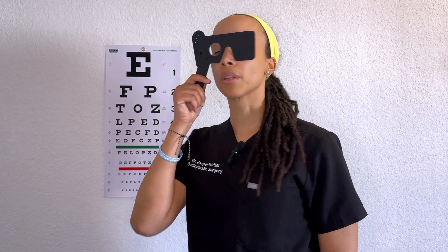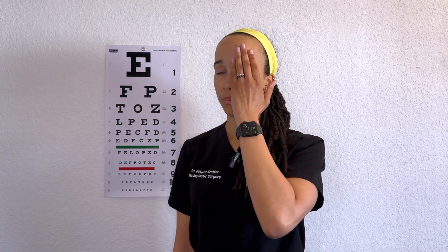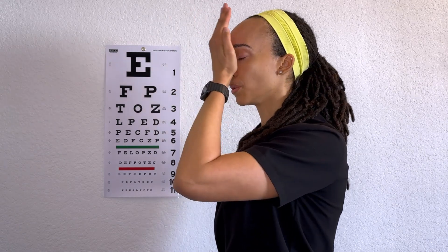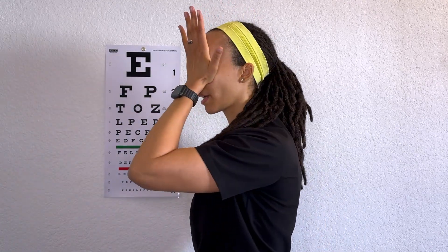One way to occlude the eye is with the pinhole occluder — say we're checking the right eye first. This goes over the nose, and now the left eye is occluded and the patient uses only the right eye. If you don't have a pinhole occluder, you can have the patient use their hand — have them cup their palm rather than a flat hand, because sometimes patients, especially if nervous, may press on the eye, which can temporarily blur the vision.